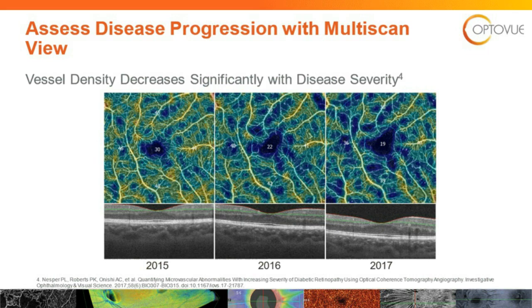But if you go up to the vessel density, you don't even have to worry about looking at the numbers, you'll see the percentages dropping. And you can see that as you go from 15 to 16, the blue lakes, which show dropout, and how expansive it had to be to even start showing some changes in the B scan. Again, another asset for following the diabetic patient in the practice.